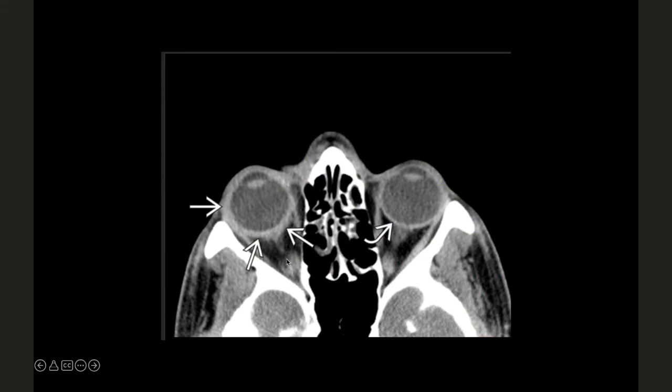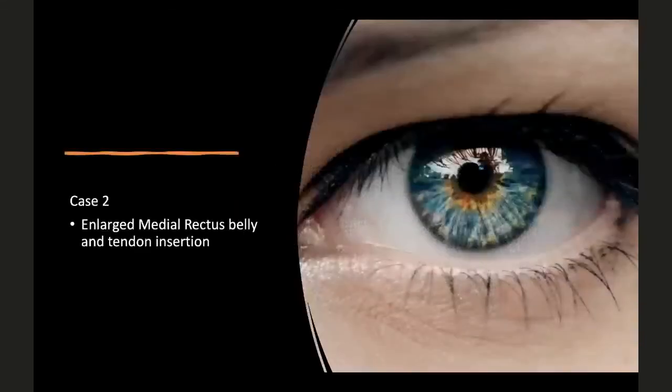So when it comes to pseudotumor, I can just see a scleral form. I can see something that involves only the optic nerve. I can see something that involves only the muscles. I can see something that involves the lacrimal gland, or I can see something that involves varying combinations of these. In this case, I think I'm looking at the retrobulbar fat as well as the sclera. So far, the muscles look good. And yes, it does go all the way around, right? It's not just here. Can it be patchy? Yes. Can it be diffuse? Yes. So it's all still falling under the same pseudotumor.